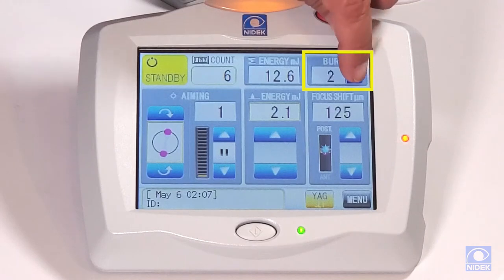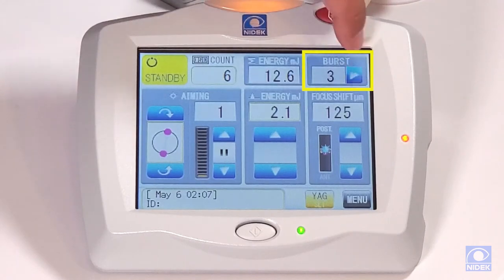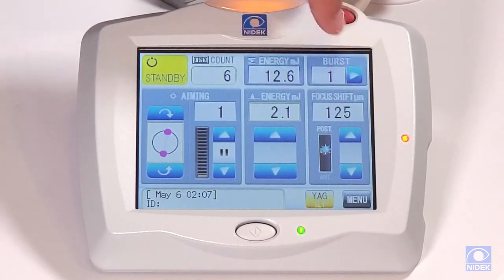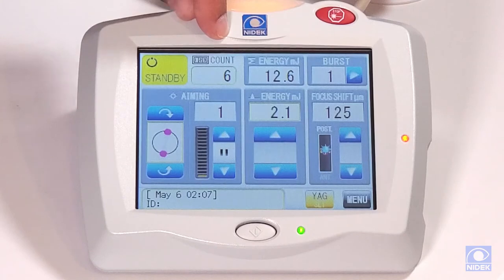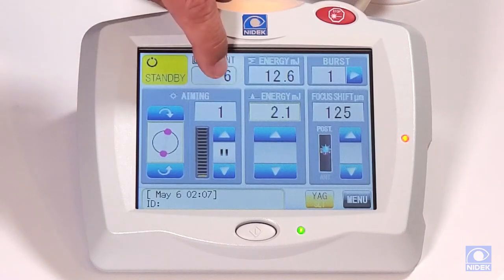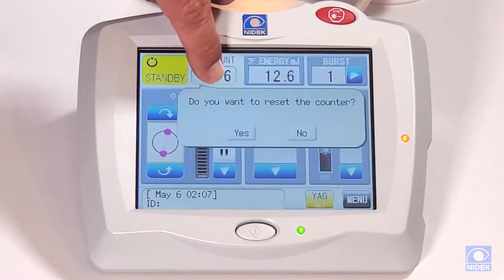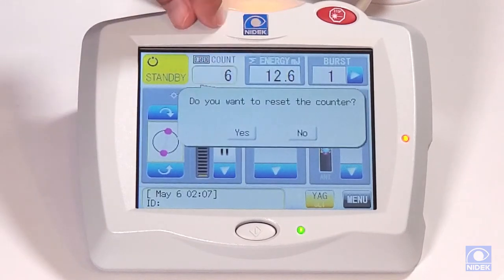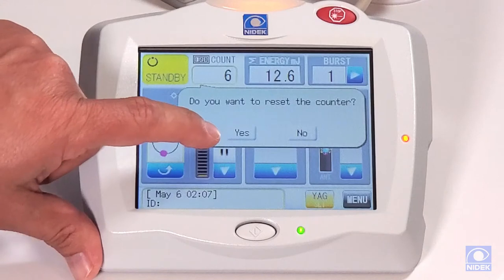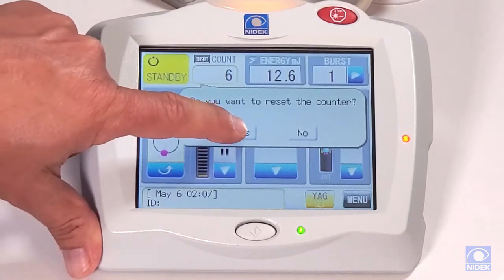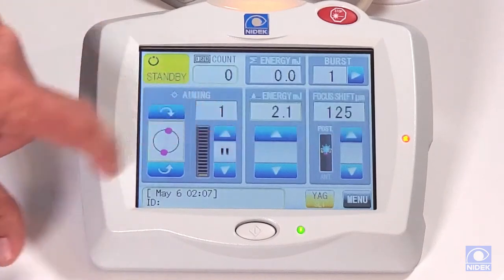For burst, you can go from one, two, or three bursts. We can also clear our counter and total energy by selecting and holding down the count button. It's going to ask us if we want to reset the counter, and we're going to say yes.